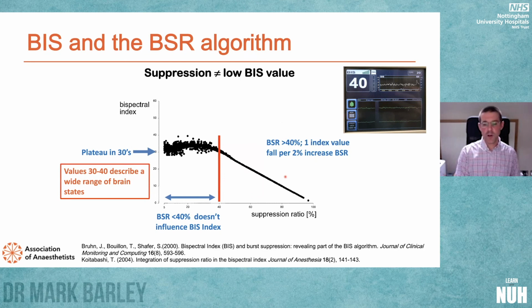Many of these monitors were designed and calibrated around the absence of recall rather than deep anesthesia. So I do strongly believe that the EEG should be shown large so we can make these deductions and adjustments to our anaesthetic ourselves, rather than just relying on these fairly simplistic and crude dimensionless values.